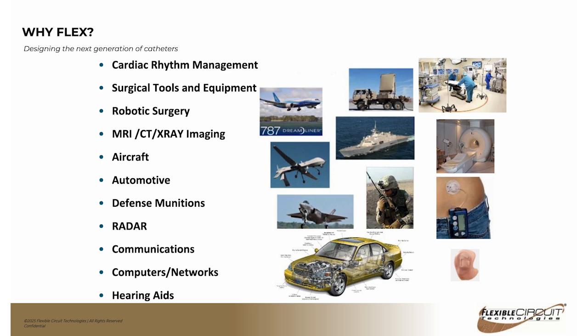It's first important to understand that flex circuits are not typically used to replace rigid PCBs. While they certainly could be used for that application, that's usually not the primary driver. In most applications, flex circuits are used to replace wire bundles or wire harnesses. So if you picture a bundle of wires that are zip tied together, if you were to cut that wire bundle and view the end cut, you'd see that much of the cross-sectional area is consumed by wire insulation and also the space between the wire insulation, because round wires don't stack well.